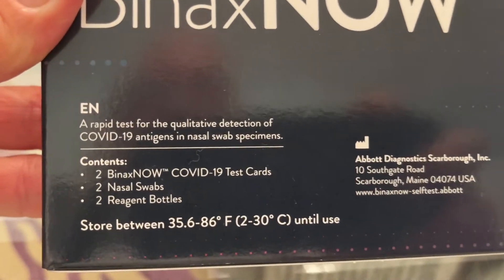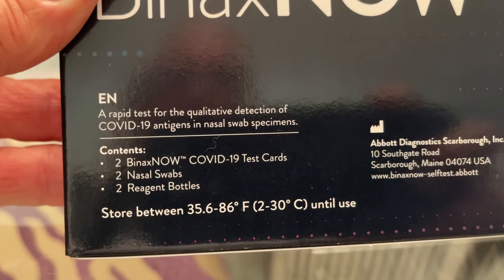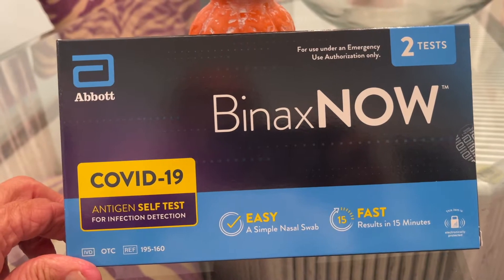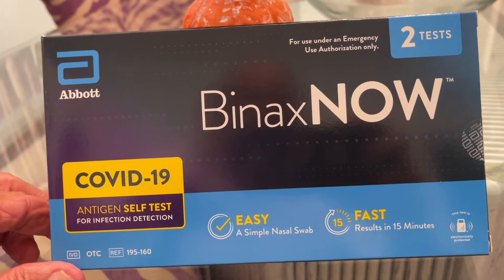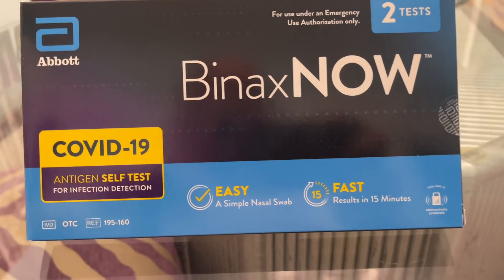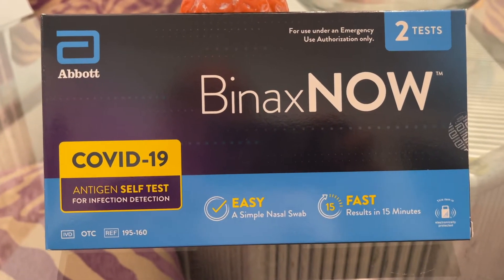This may make you feel better. It comes with two test cards, two nasal swabs, and two reagent bottles, and we're going to show you how this works right now. The Abbott BinaxNOW two-test COVID-19 antigen self-test — it's easy, simple nasal swabs, fast, results in 15 minutes. You could get false positives and false negatives, so this isn't the end all. The PCR test is probably the best way to go, but that takes like three or four days to get back, which is ridiculous.